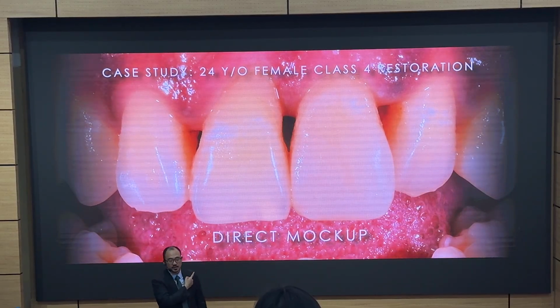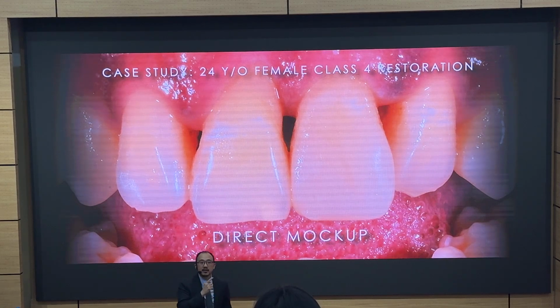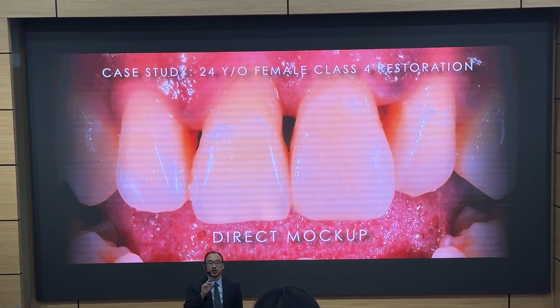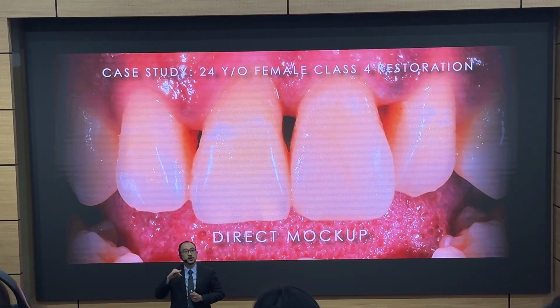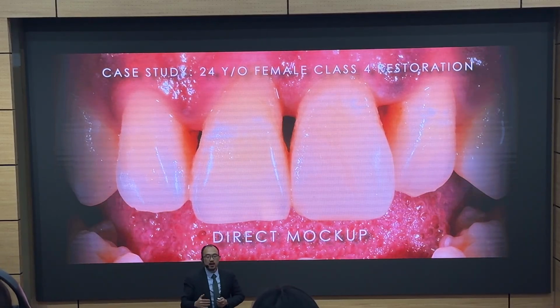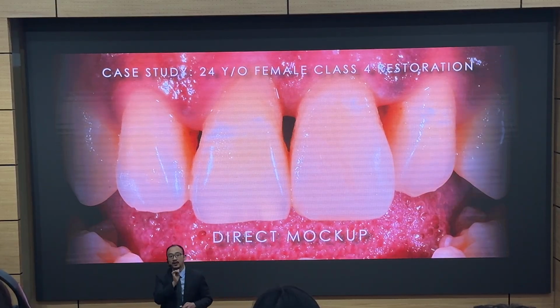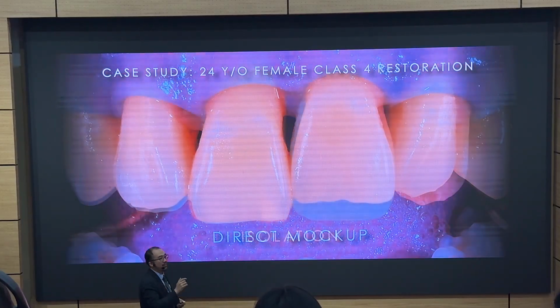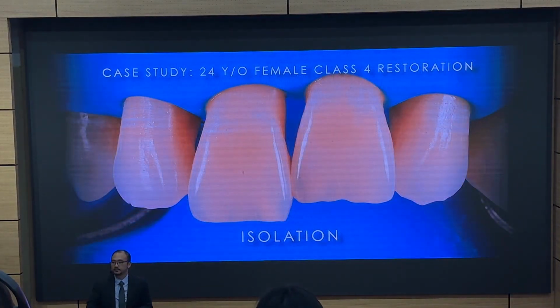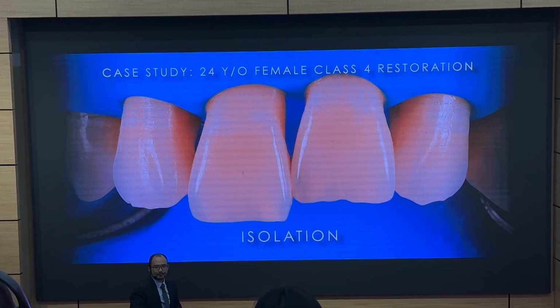If she says yes, what I will then do is very quickly and roughly adjust the palatal surface to make sure that when she bites, it doesn't knock it off. Then, once that's fine, I take a putty index, just like we saw a while ago, directly in the patient's mouth. So I copy that, and then I flick it off. Make sense so far?